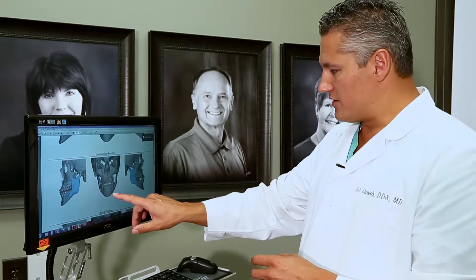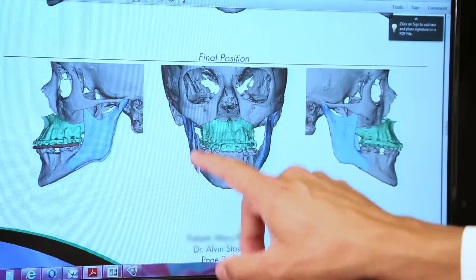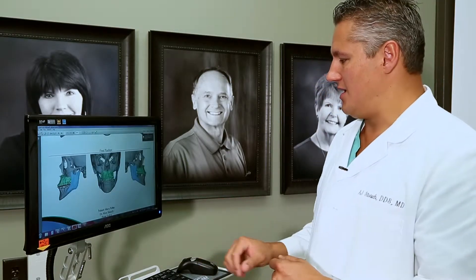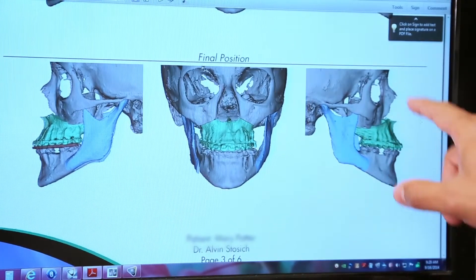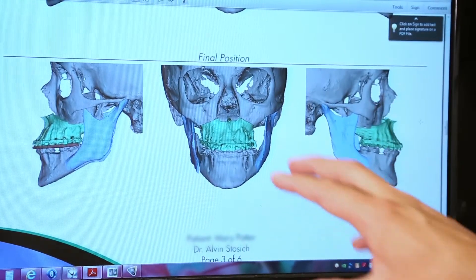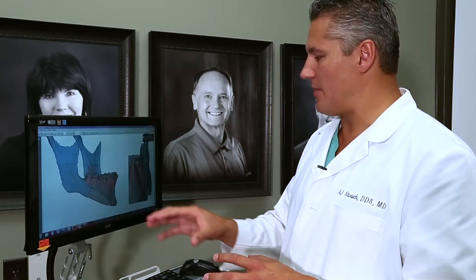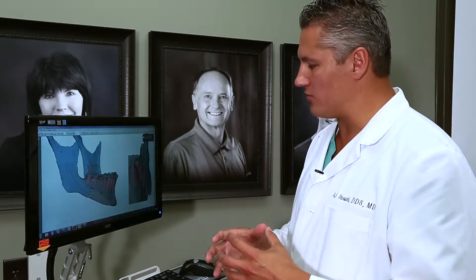I can see where there are certain asymmetries — some I may be able to correct and some I may not. But for the most part, it allows me to manipulate the jaws so that things look fantastic. You can see that where the different colors are is actually where the bone cuts are made. This is our side view that we were looking at previously in that single x-ray, but now I can also see the patient from the front — not only where I can make bone cuts but also where asymmetries may develop while I'm doing surgery.